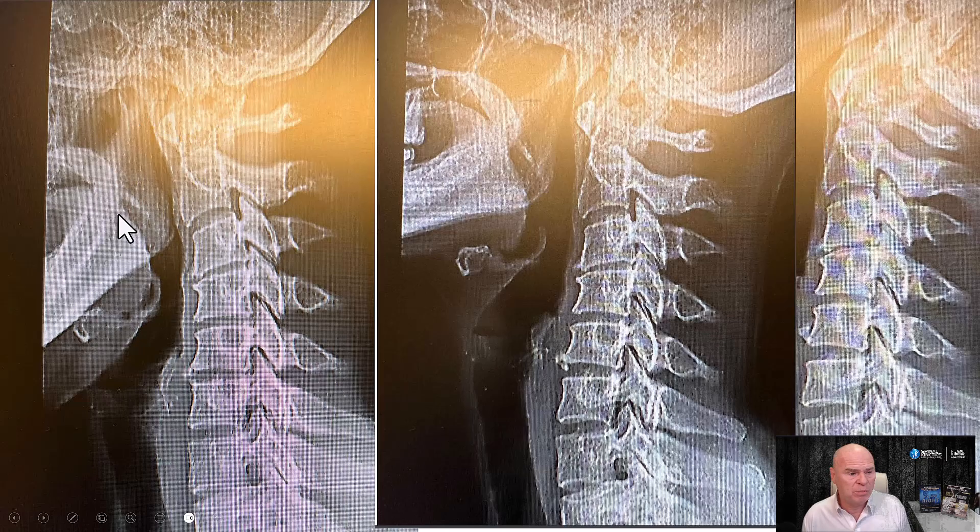This patient should be farther forward — they should be pushing down further, which I'll show you in just a second. In the extension, unless the patient is unable to get into these positions due to inflammatory conditions or pain, that's going to restrict the range of motion. What you want to do is treat to free that up and then take these images and send them in.